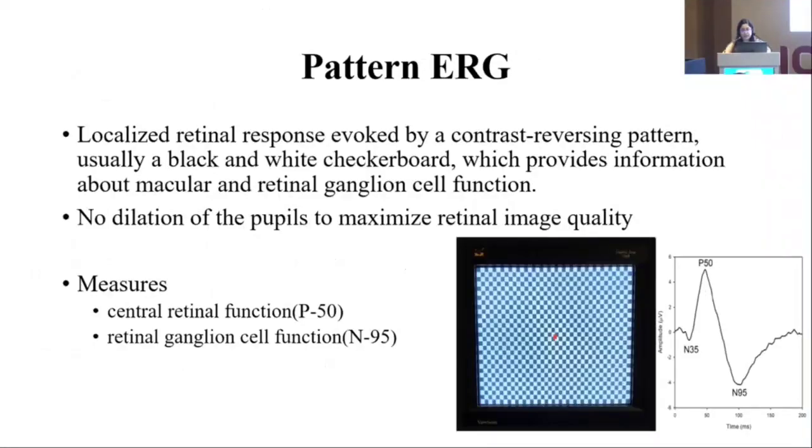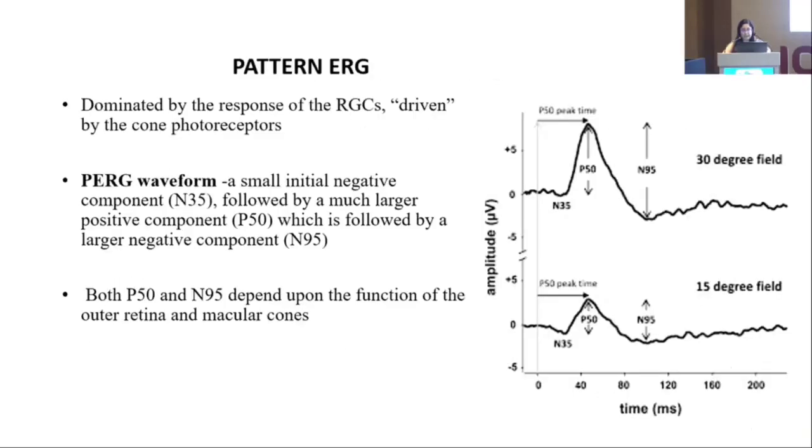Pattern ERG is a localized retinal response evoked by a contrast reversing pattern. There is no dilation of pupils, to maximize the retinal image quality. It's dominated by the response of RGCs driven by cone photoreceptors.